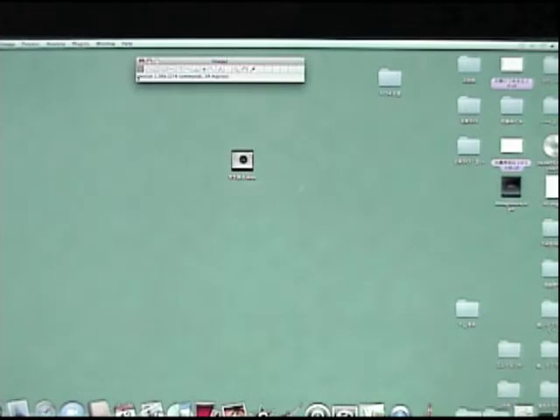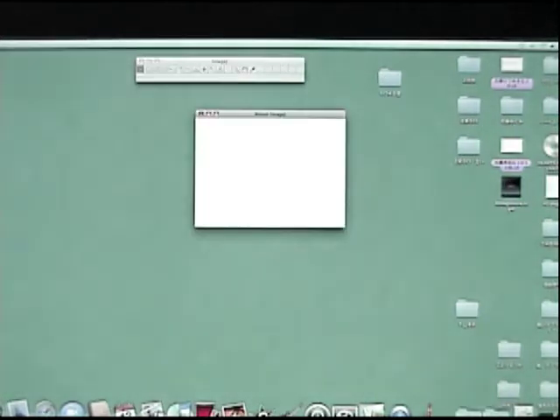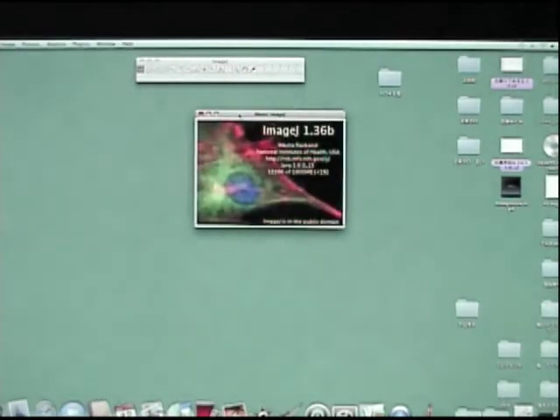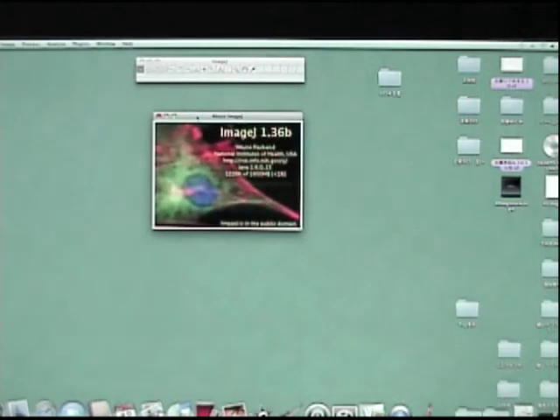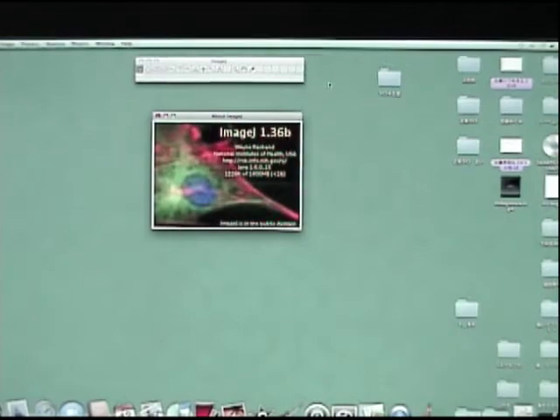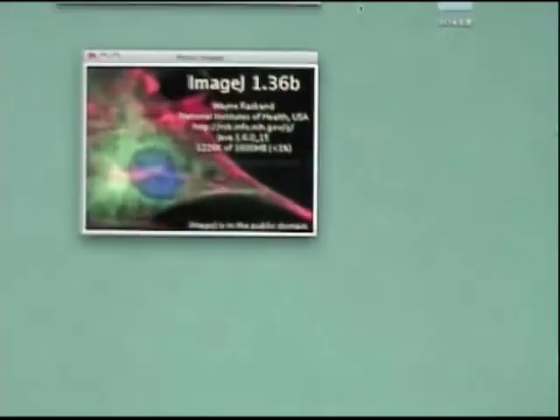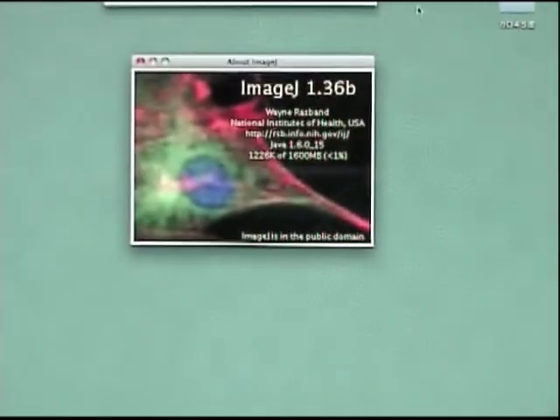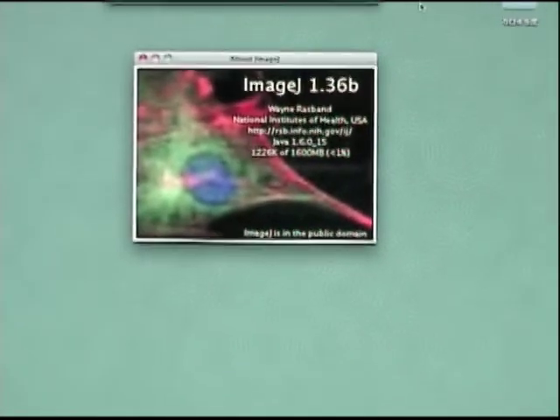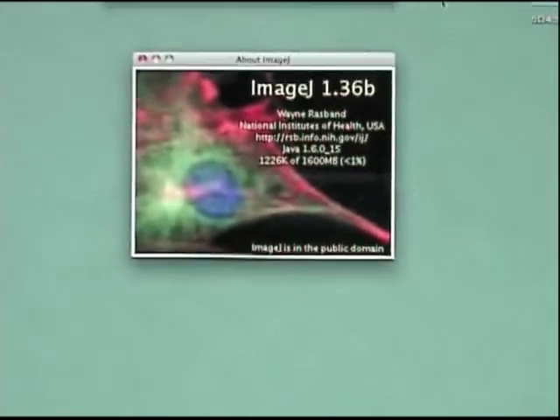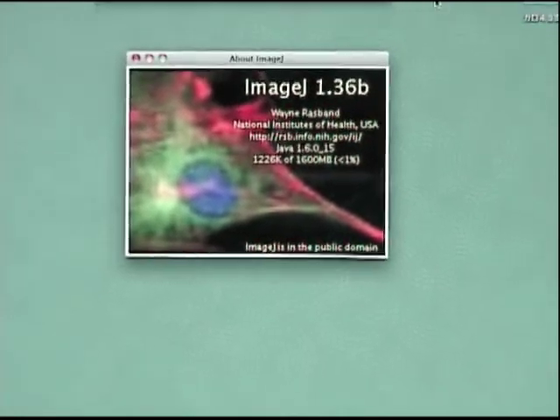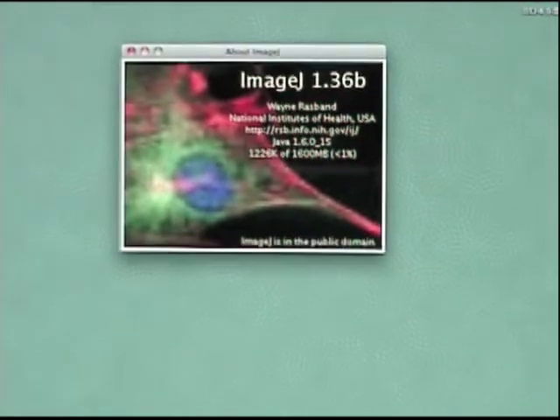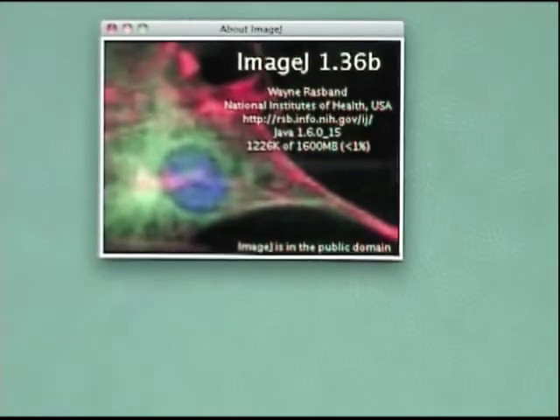Launch ImageJ. ImageJ is a public domain Java-based image processing program developed at the NIH.